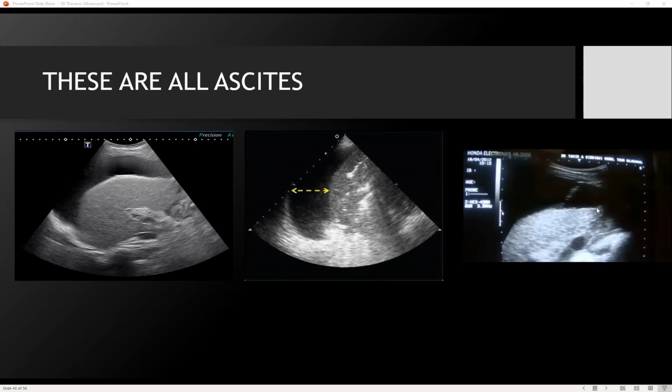And here too, same problem. You don't have the thick overlying diaphragm, you don't have a costophrenic angle, you have to keep scanning upwards, and sometimes you will be surprised how high the diaphragm can rise. Sometimes you're literally in the axilla when you're finding the diaphragm. It's not uncommon at all.